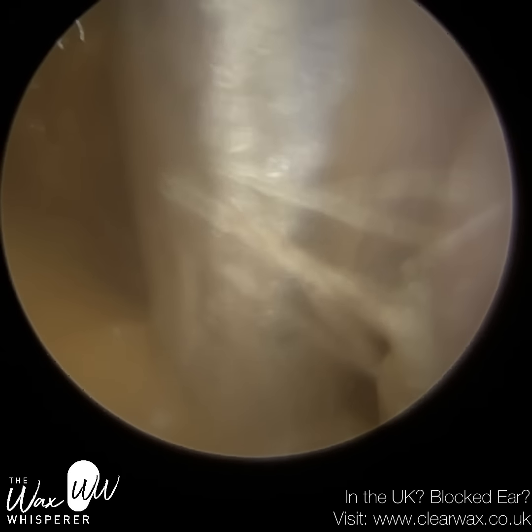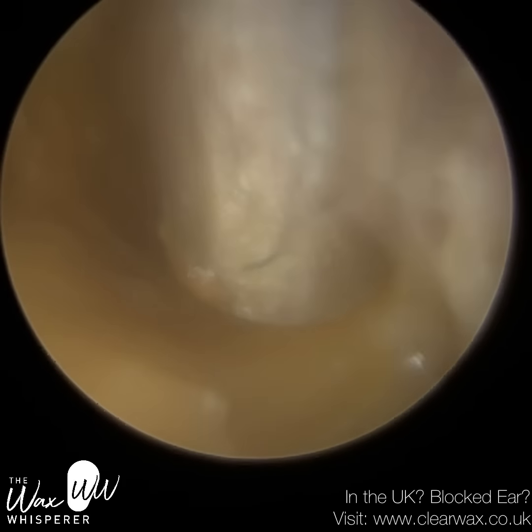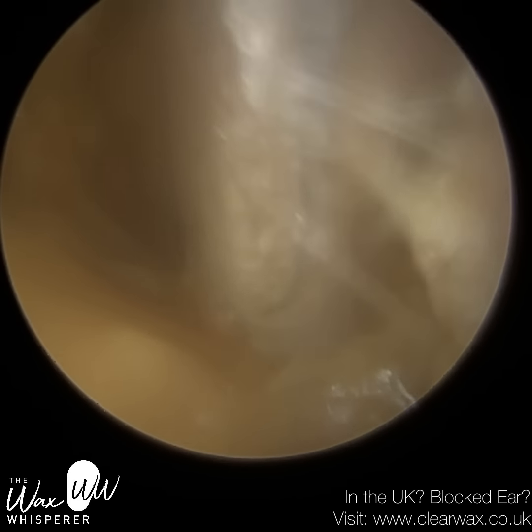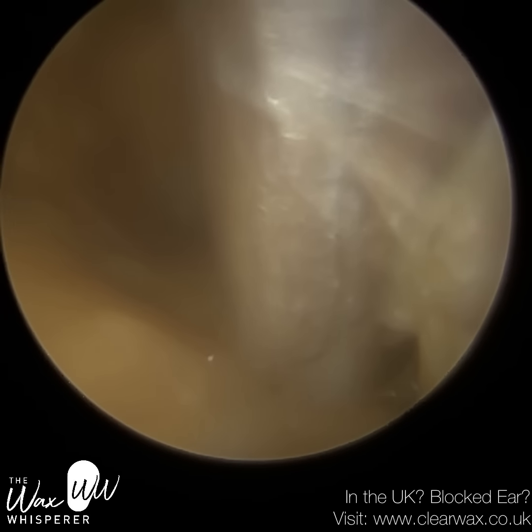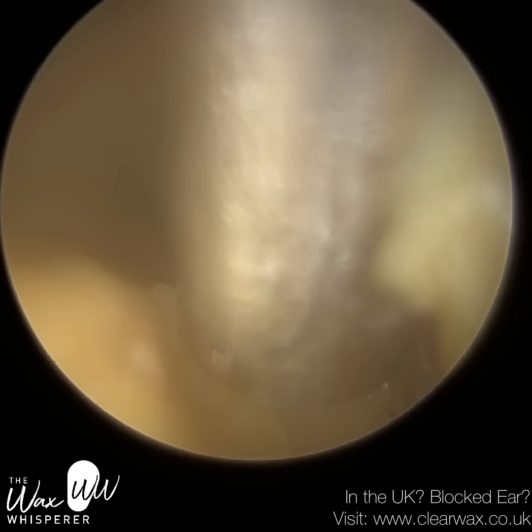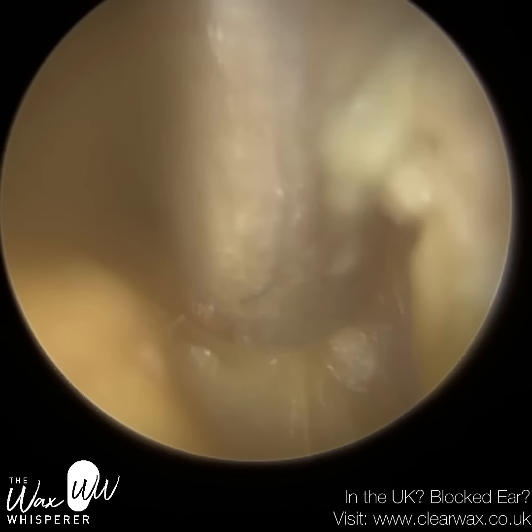Being an audiologist, we're very experienced working in the ear. You have a gut feeling, but we never want to make guesses when we're in someone's ear, well, at least I don't, and it's always best to be precise about these things. But nonetheless, we can gauge, due to the shape of the ear and the shadows in the ear, approximately how deep we are in and where one can safely assume the eardrum is.